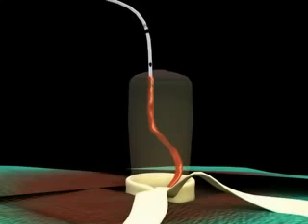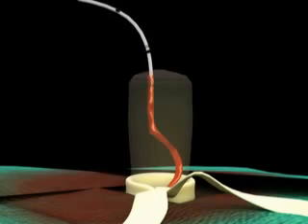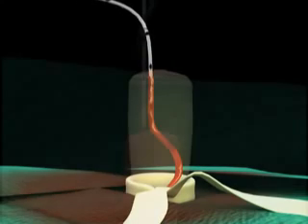If insertion is easy but there is no blood return, or if you sense a pop after entering the lumen, the catheter may be in a false track outside the vessel. Remove the catheter and prepare the other umbilical artery for insertion.